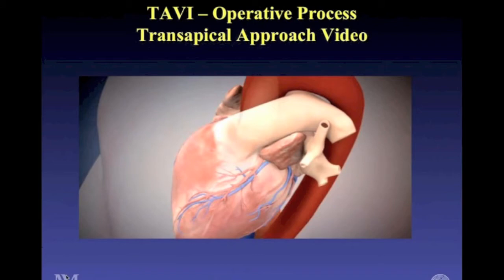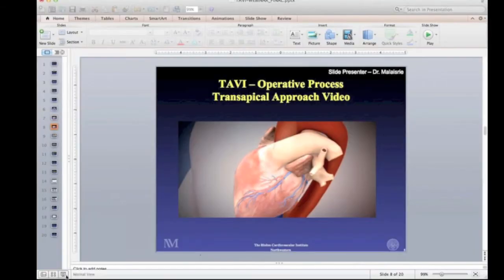Dr. Davidson gave a very nice overview of both the transfemoral, going through the groin, and the transapical, which is going to the tip of the heart approach for this particular valve. Go ahead and play this video, please.